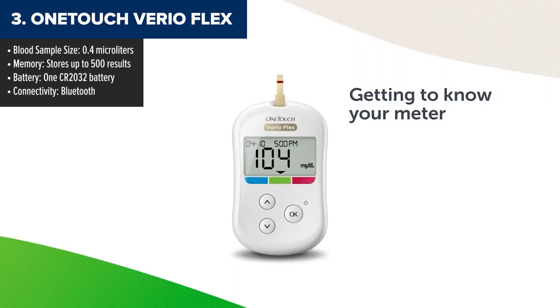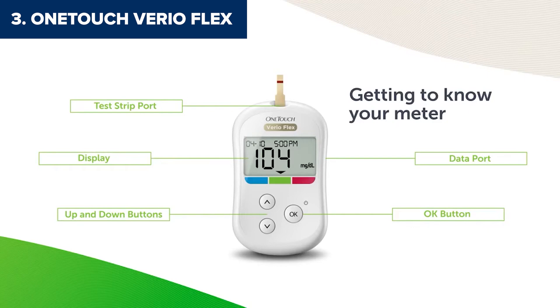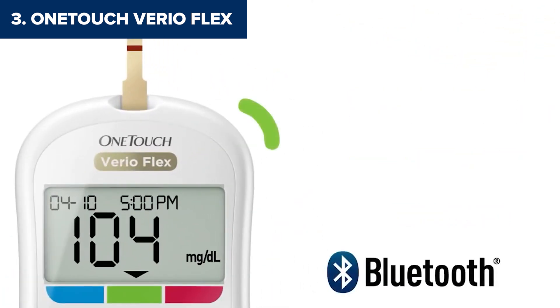Taking the third spot is the OneTouch VarioFlex, which strikes a great balance between simplicity and modern functionality. It's compact, portable, and offers Bluetooth connectivity to sync with the OneTouch Reveal app, making it perfect for tech-savvy users. One of its coolest features is ColorSure technology, which gives you an instant visual indicator of whether your blood glucose levels are below, within, or above your target range.